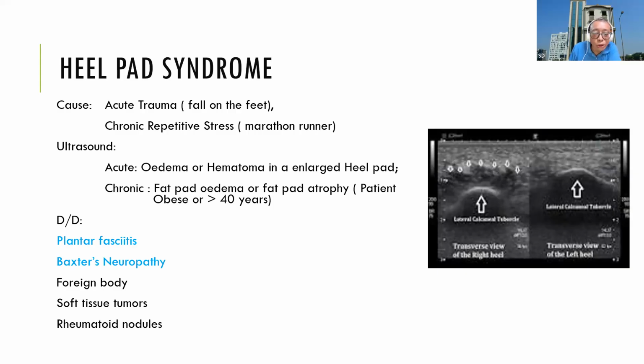Second is Baxter's neuropathy, which is also very common. Third, foreign body in the foot is also common, because sometimes we walk barefoot, and various foreign bodies can find their way into the plantar aspect of the foot. And rarely, soft tissue tumors or rheumatoid nodules can be a cause of inferior aspect foot pain.